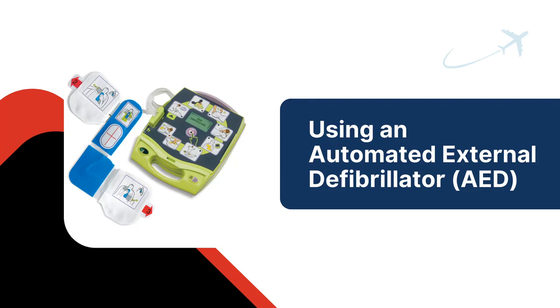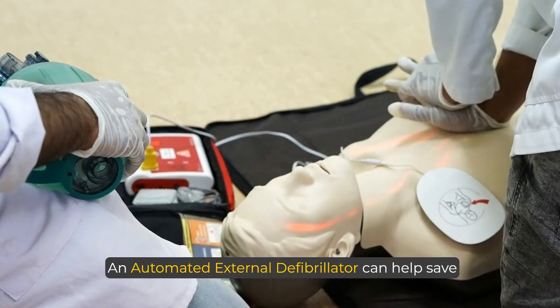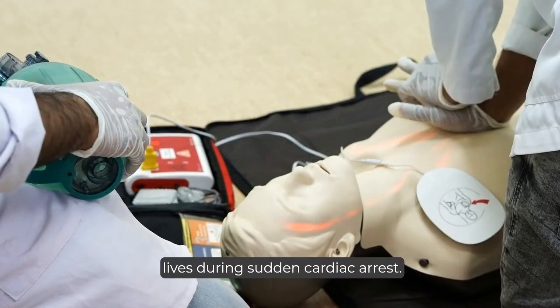Using an automated external defibrillator, AED. AEDs are carried on most commercial aircraft and are used for heart-related emergencies. Cabin crew are trained and qualified in the use of this equipment, which is crucial for responding to cardiac events and potentially saving lives. An automated external defibrillator can help save lives during sudden cardiac arrest.